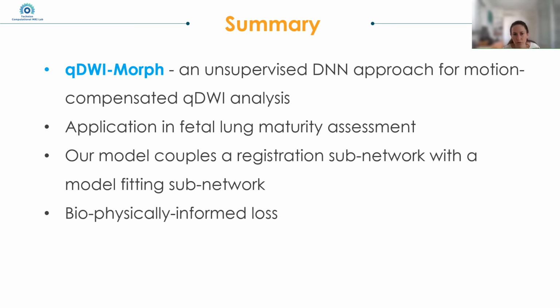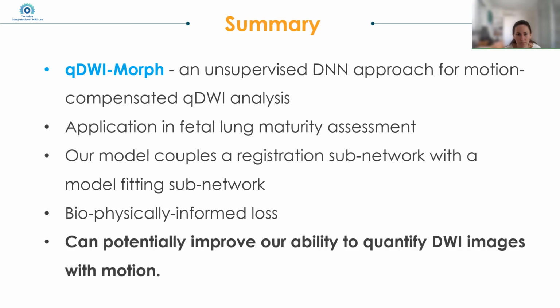The optimization of the model weight is driven by minimizing a biophysically informed loss representing both the registration loss and the fit quality loss. The proposed method can potentially improve our ability to quantify diffusion-weighted MRI images with motion.